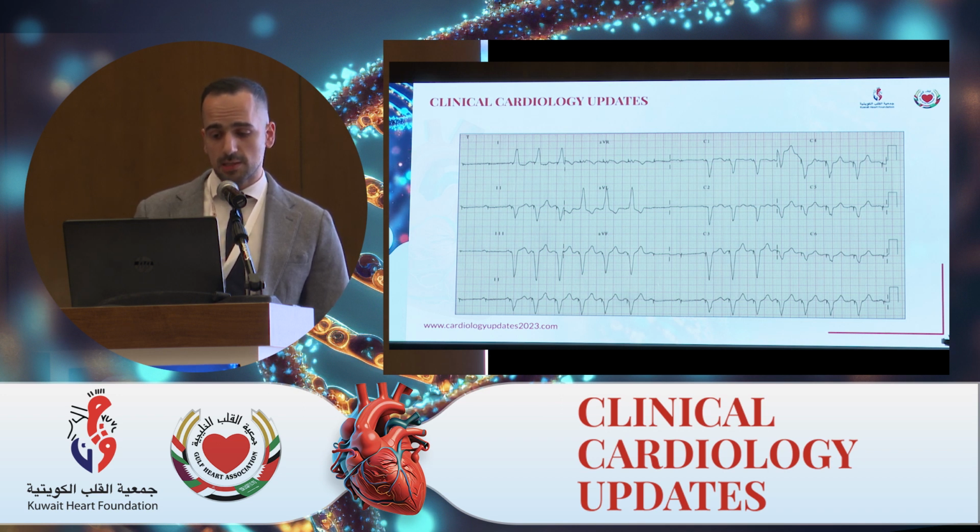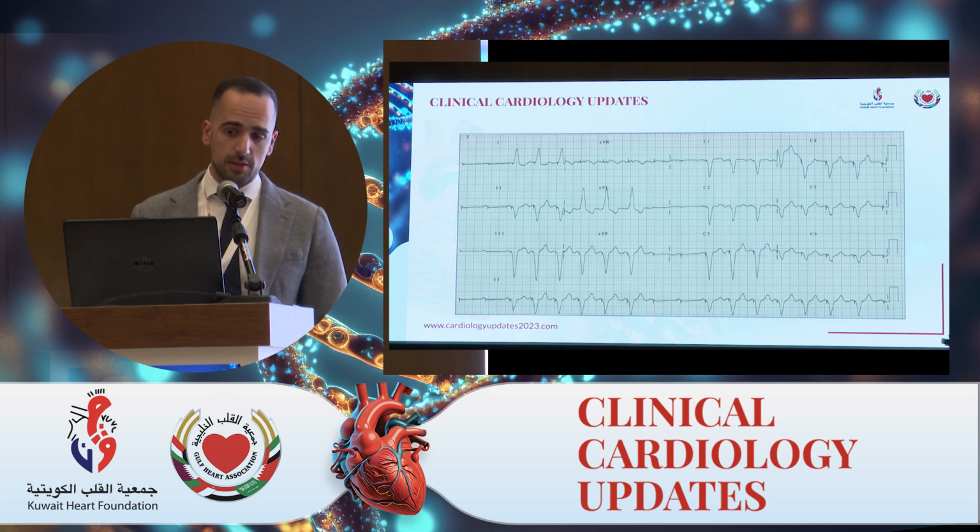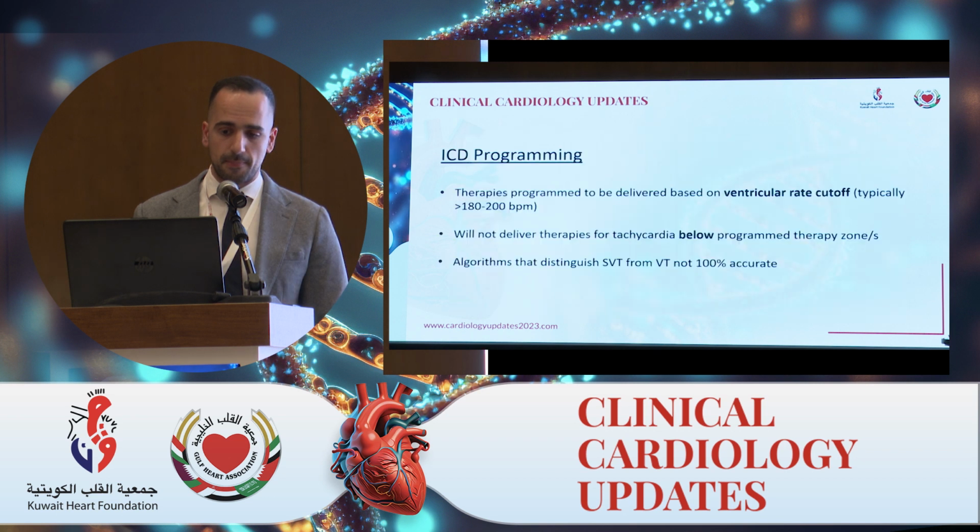The pacemaker is pacing, but the lead is not capturing. And in this patient, the lead had been pulled quite a bit, and it was on the verge of dislodging, and this patient needed a lead revision. So this is a classic example of, okay, this patient has a pacemaker malfunction, we should alert the electrophysiologist.